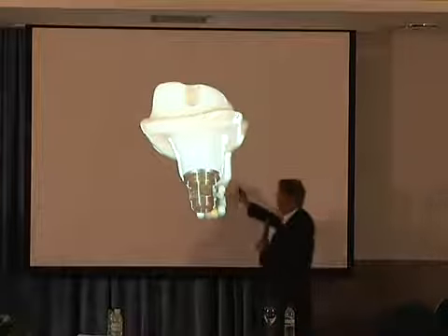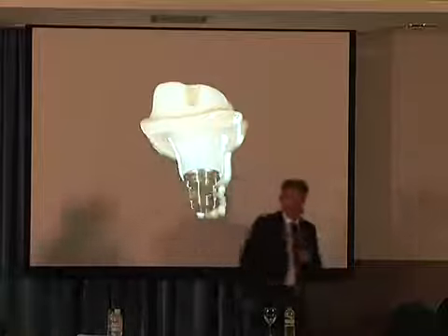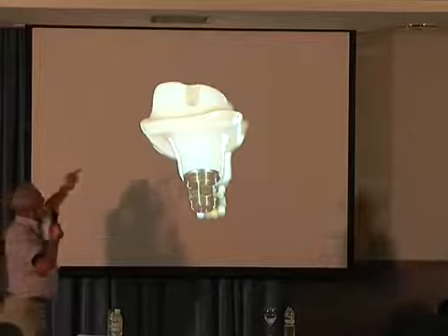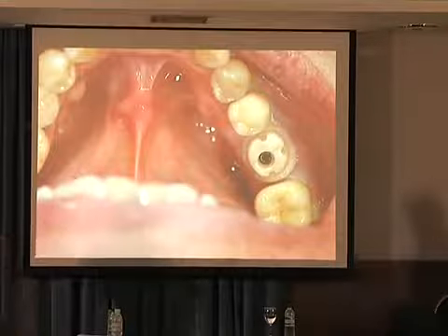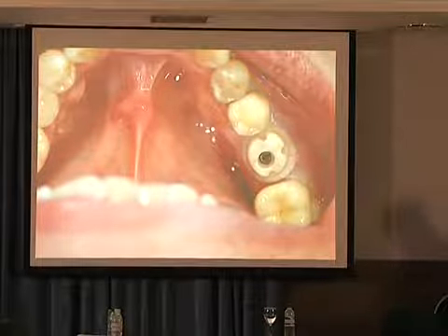This is the abutment that was fabricated, platform shifting, the border for the crown. Zirconia, of course, the connection and the margin made on the zirconia abutment. Fixed with ratchet and torque.